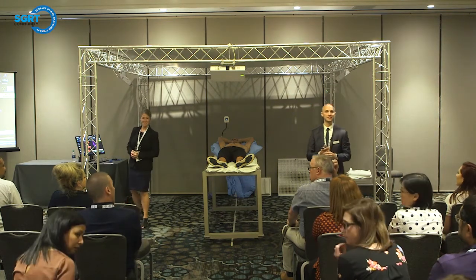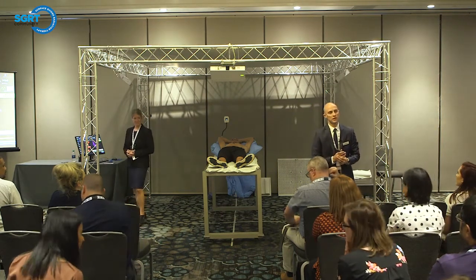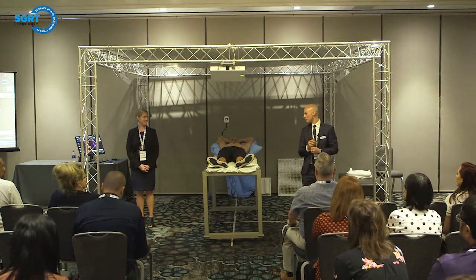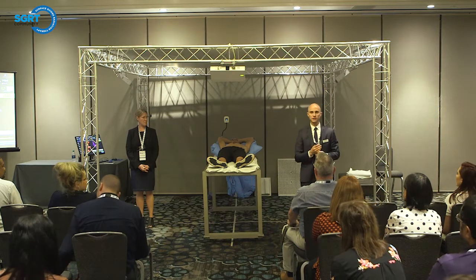Yeah. For the sim? Yeah, so there's a lot of good tips that can come from the simulation, right, that we want. One of the biggest things I could suggest is have them take a breath through their nose.